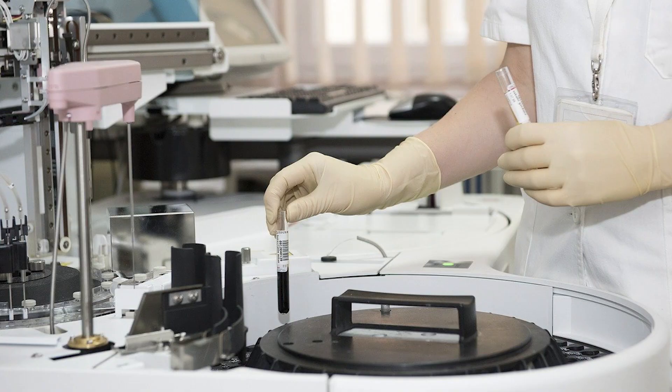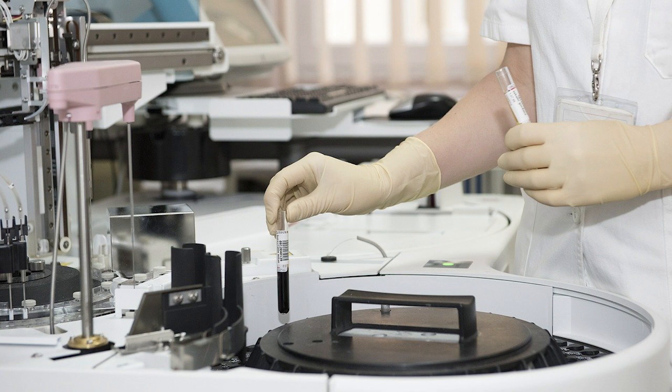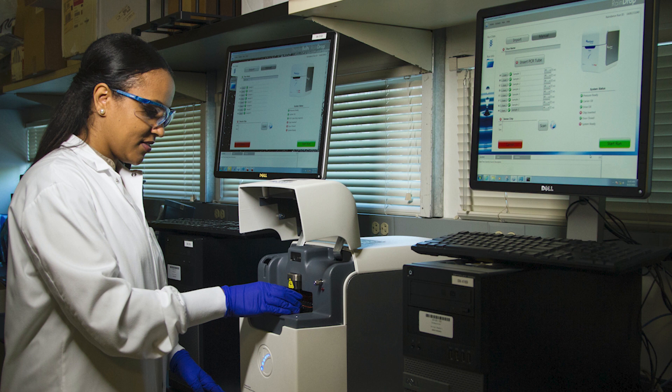To get good results, the instrument should be in good condition. Check the daily maintenance and the weekly maintenance of the instrument. Check the cleaning solution, rinse, and all the instrument reagents. Everybody wants to get a QC at first run. Inadequate reagents can form air bubbles while changing in the middle of the run.